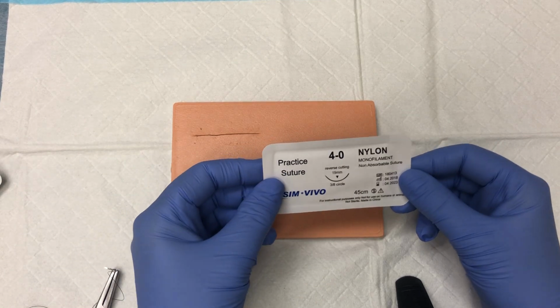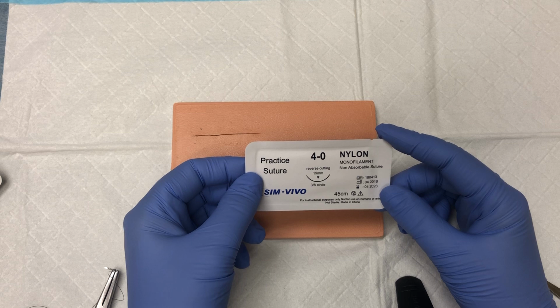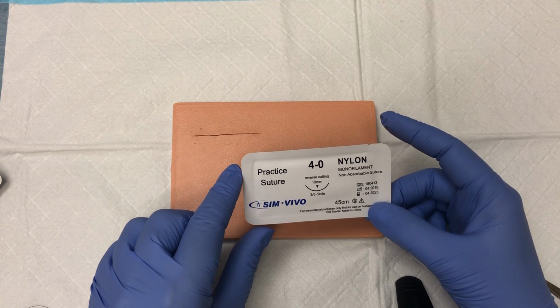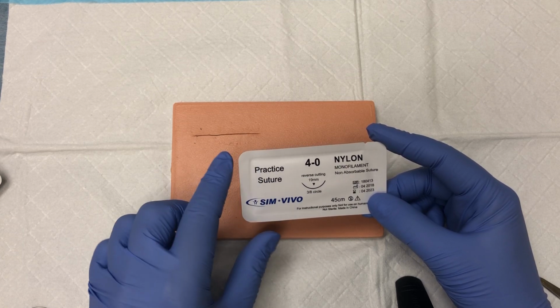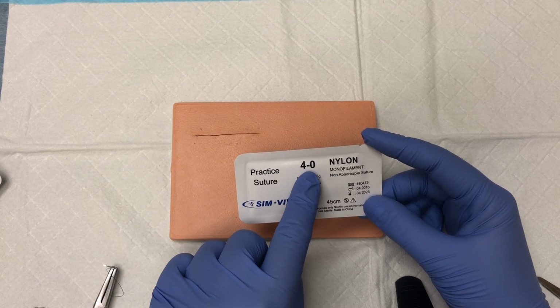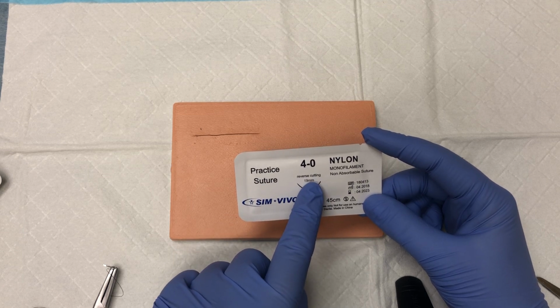So in this lecture, we're going to cover some of the basics as well as simple interrupted suture placement. And as we discussed in the lecture, your packaging actually gives you quite a bit of information. So this is going to tell you, number one, that it's a practice suture, so it's likely not sterile. Please do not use at home. It's a 4-0 in terms of the overall size of the suture itself. It tells you it's a reverse cutting needle.